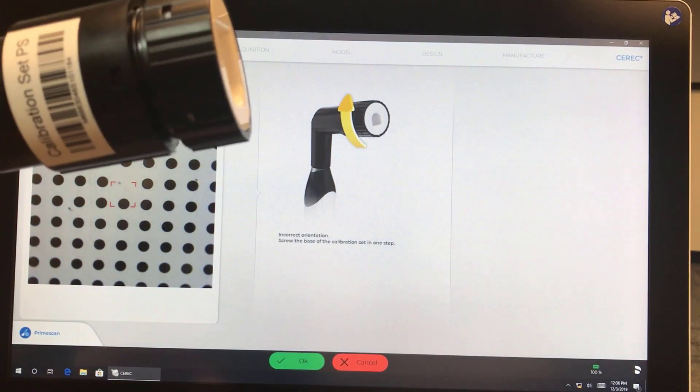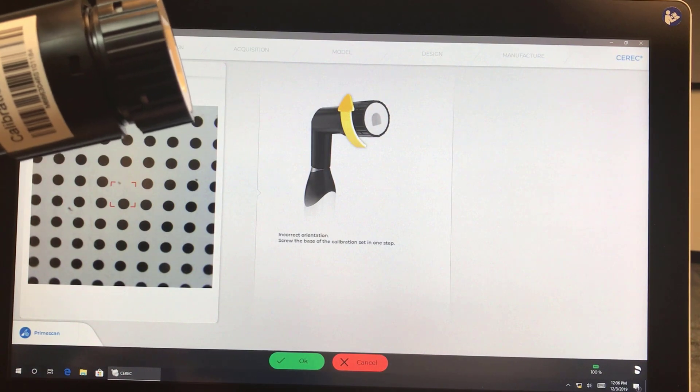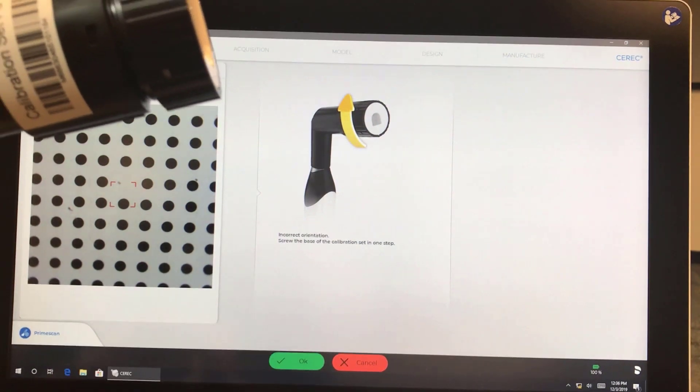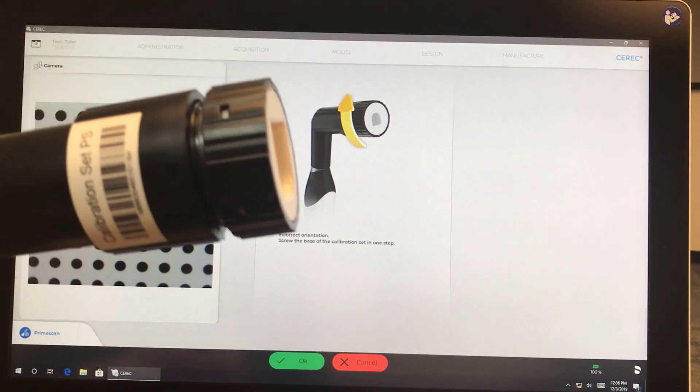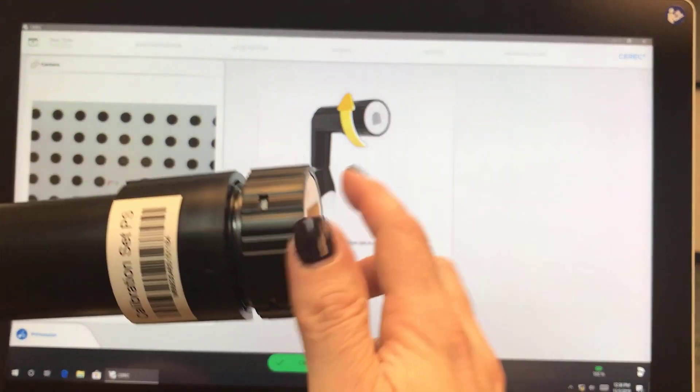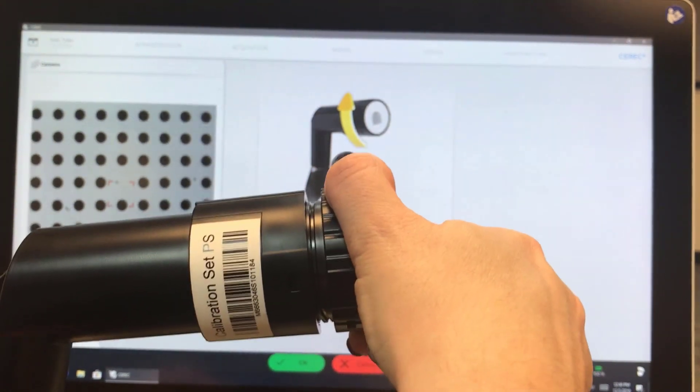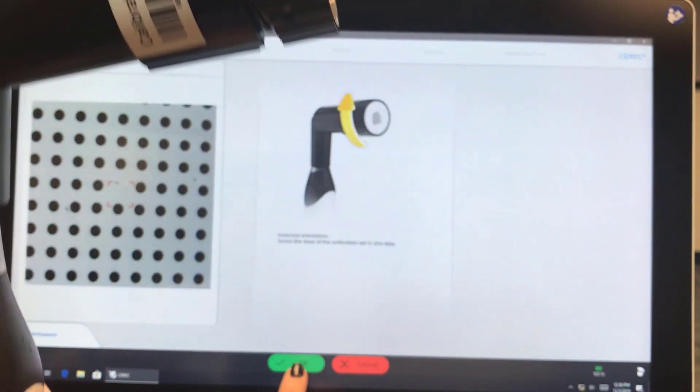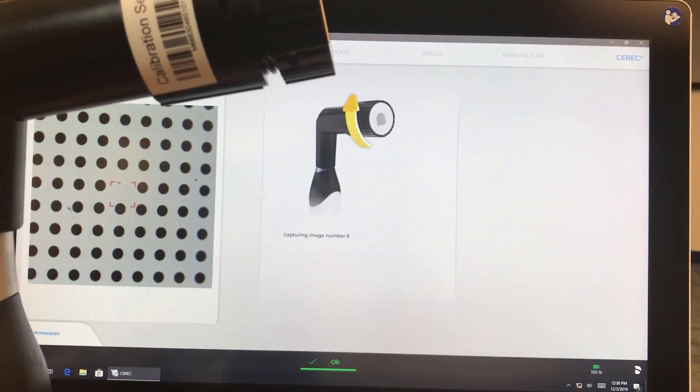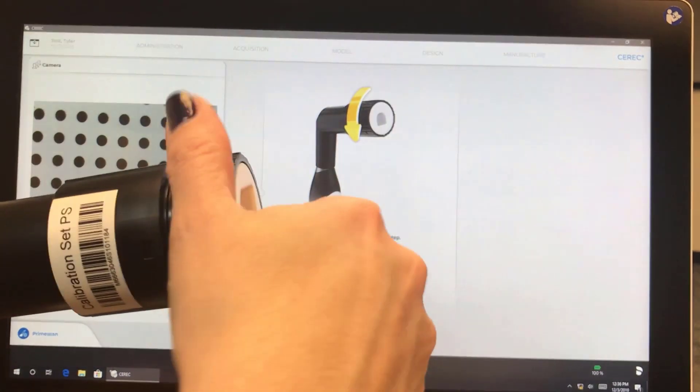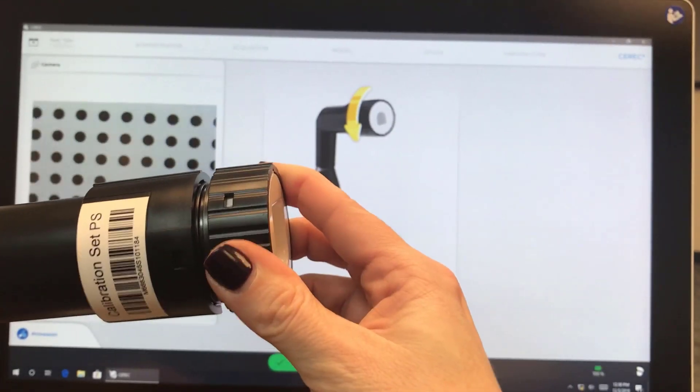If you make a mistake, it's going to tell you that you made a mistake. So it's telling me incorrect orientation. So it shows me what I need to do. I need to go back one step. Hit OK. And now just continue following the instructions.